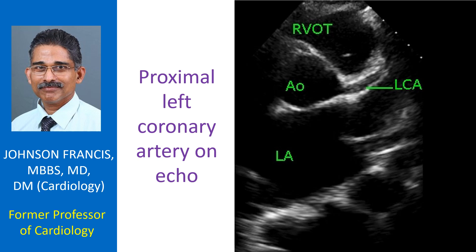Proximal portions of major coronary arteries can often be seen on echocardiography, while the distal regions can seldom be imaged. Coronary arteries are better seen if they are dilated, especially in those with aneurysms in Kawasaki disease.